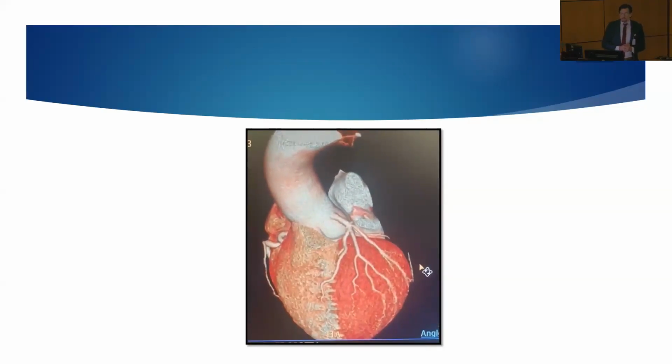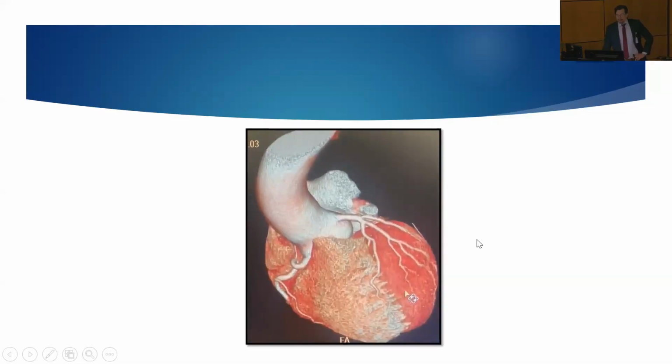You can also see coronary artery bypass grafts where they come off the aorta, where they touch down, if you don't have the op report to guide you where the bypass grafts originate from and are actually going. And this can also be helpful for our cath lab guys, when they go into the lab and want to know where the bypass grafts are coming from when they try to engage them in the aorta. So it's a great tool just to give us a layout.